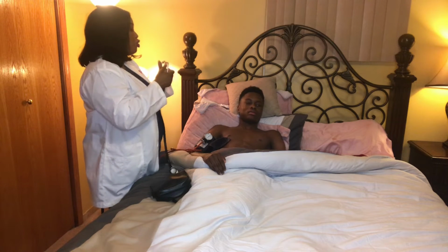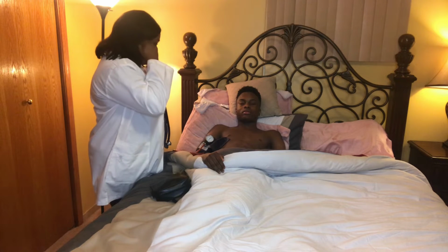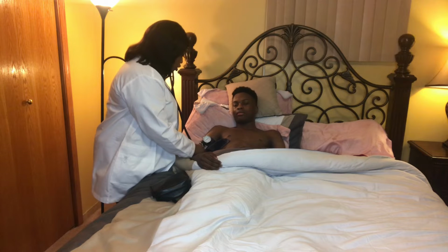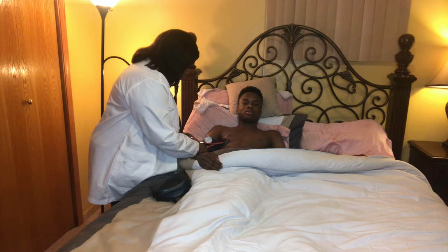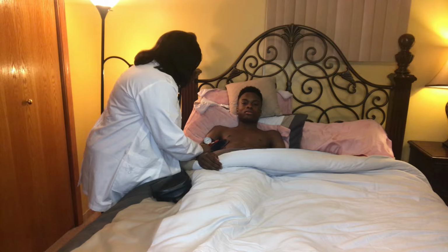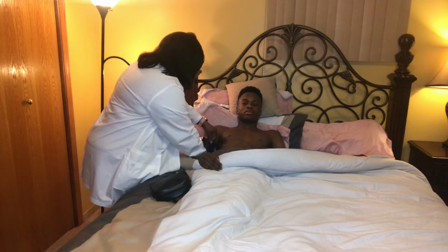I have my stethoscope to listen to your systolic blood pressure and also your diastolic blood pressure. Your systolic blood pressure is the top number of your blood pressure, while the diastolic blood pressure is the lower number. Okay. Awesome. Your blood pressure reads 110/60.